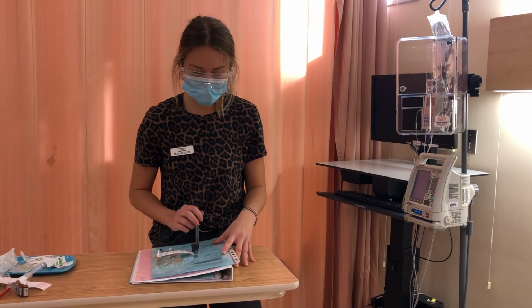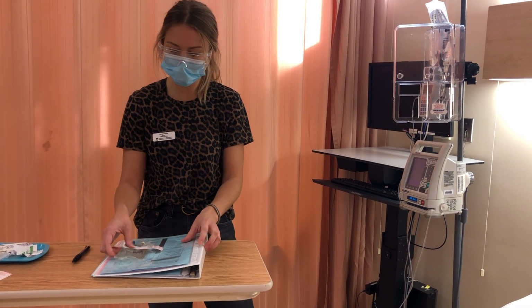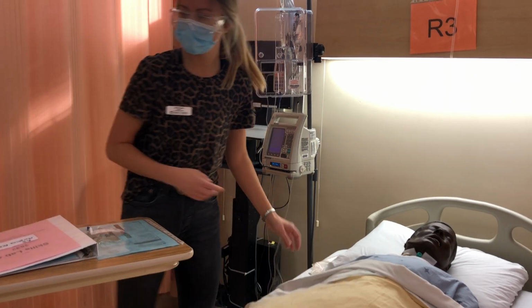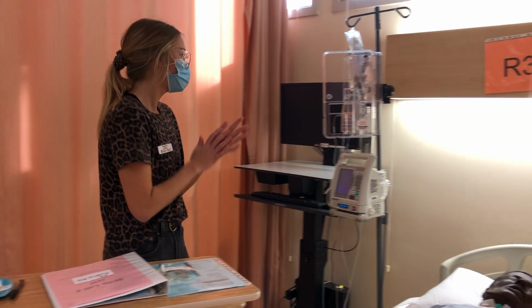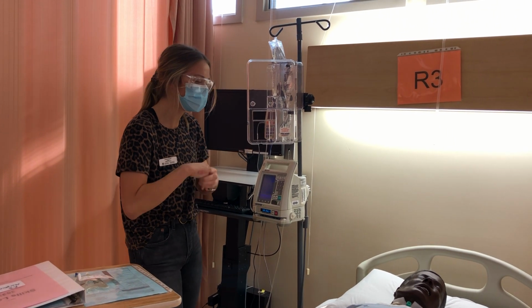And the right time to be changed is now. So that is good, and it's logged every 5 minutes. And wonderful. Alright, so I'm just going to wash my hands again. I would have washed my hands before I took the wristband as I entered the room for future reference.